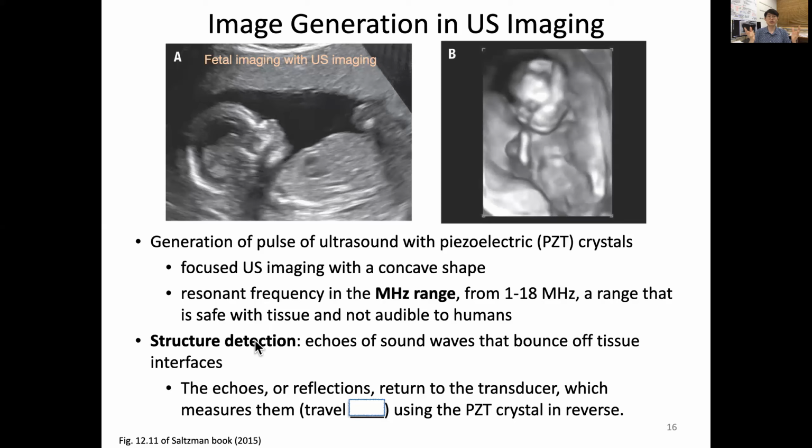The principle is exactly the same. The only thing is we are not using sound waves inside the air. We are using ultrasound inside the aqueous medium, inside the body. So the echo of sound waves that bounces off at tissue interfaces, we use to detect the structure.